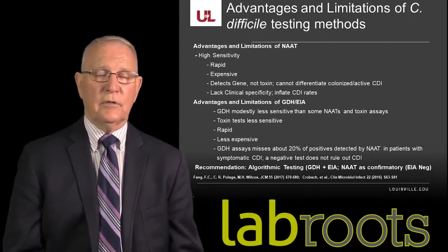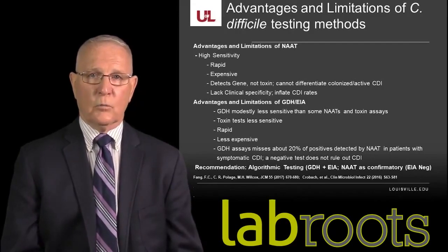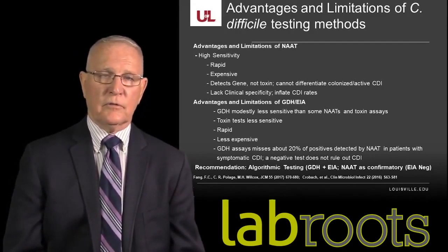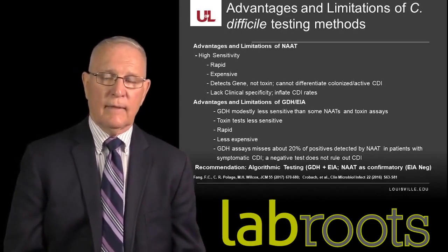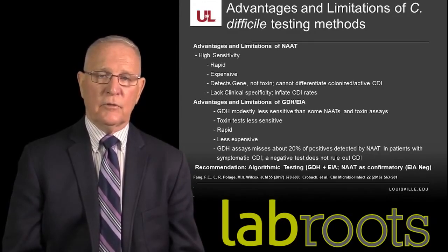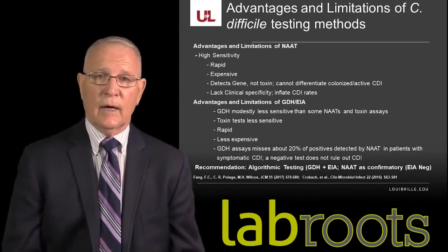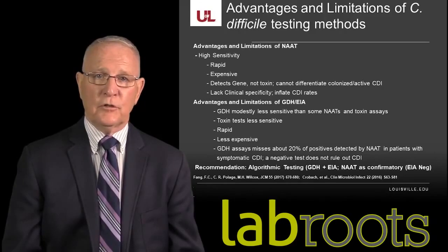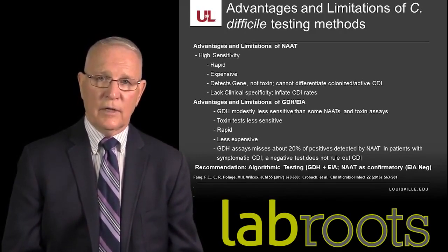So if you're doing direct PCR, the high sensitivity associated with that technology has a tendency to overcall and inflate the rates of Clostridium difficile infection. That is very, very important from the perspective of reimbursement. Most of you, or maybe all of you, are familiar with the CMS guidelines known as value-based purchasing, which penalize institutions that have excessive CDI rates.